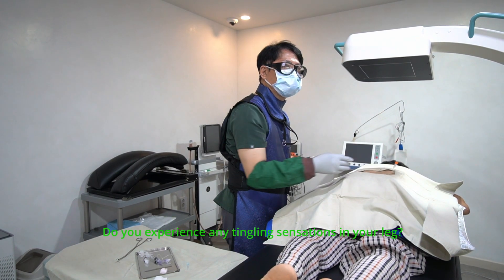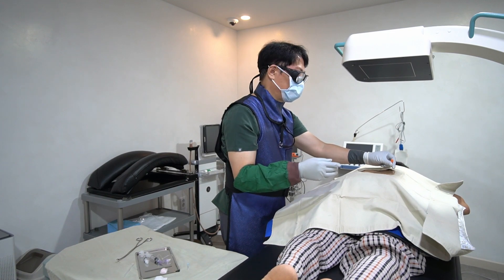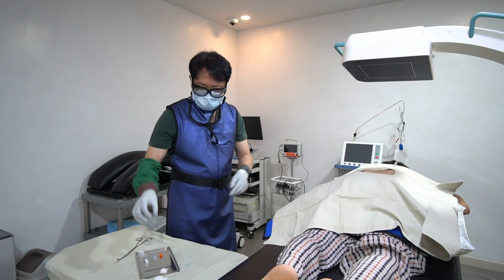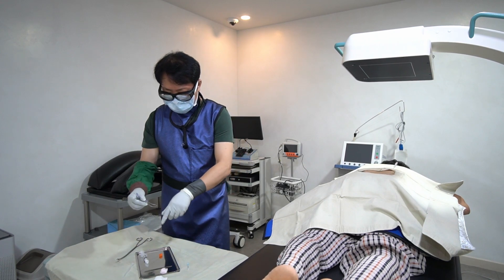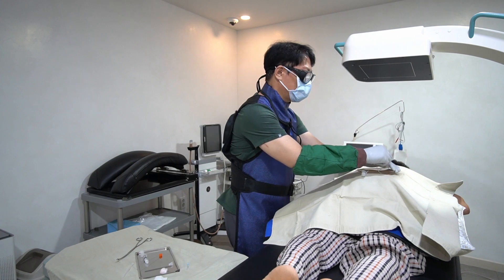Resorting to sedation can be detrimental and escalate the potential for accidental nerve damage. Before committing to this adjusted target, conduct a preliminary injection with a minimal contrast volume. If satisfactory, proceed with a more substantial amount to enhance the visibility of the sub-radicular, transforaminal, and epidural regions.